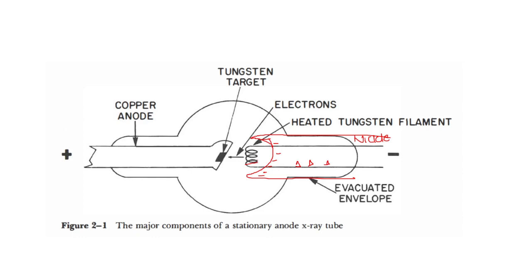So how are we going to achieve this? When the cathode and anode are connected to a high potential difference, the filament immediately gets heated. When the filament is heated for a longer period, the tungsten filament might become thin and break. To prevent that, we have designed a standby circuit. In the standby circuit, initially a potential difference is applied between the cathode and anode, and only a small current, just 5 milliamperes, is allowed to pass between them. This is sufficient to heat the filament.